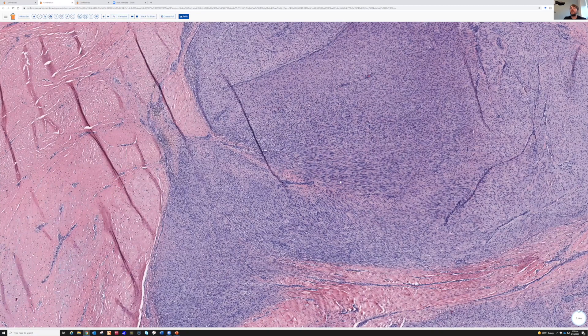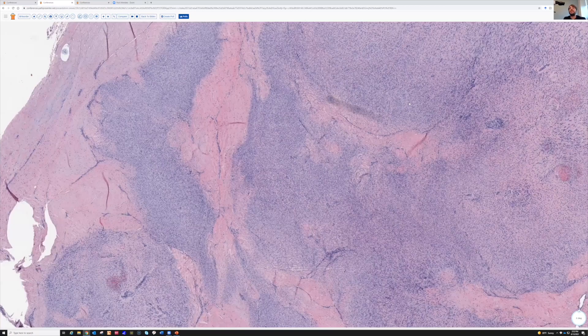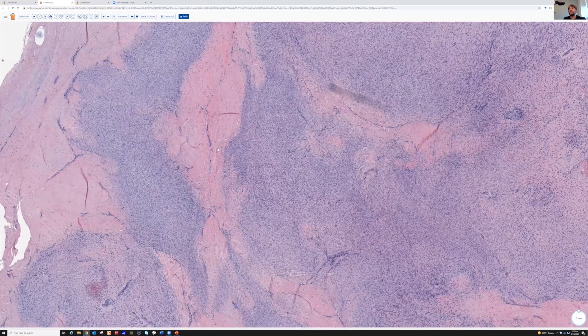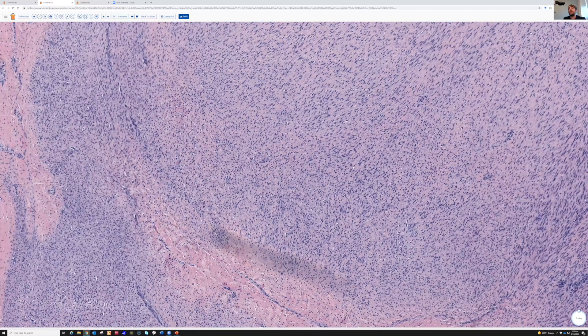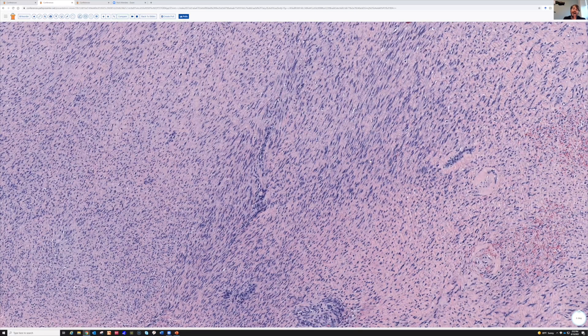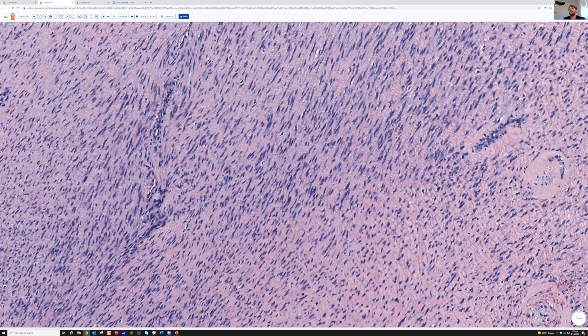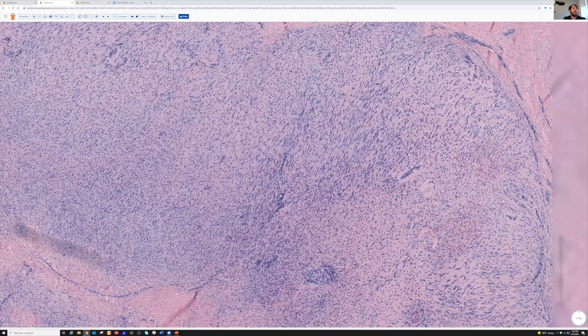We've talked about it to death, but I think it's important because these are relatively common entities and they really can trick you because of the reasons we described. In general, you can usually diagnose them on H&E. And again, a little bit of that ramen noodle effect right here — see, it's wavy, not neural though. So that's a plantar fibromatosis.